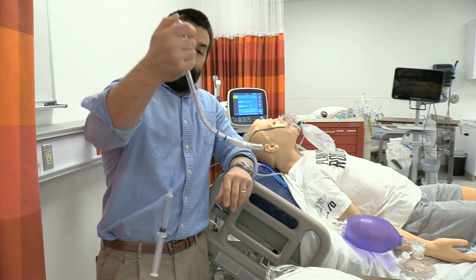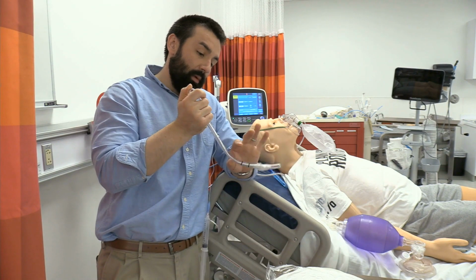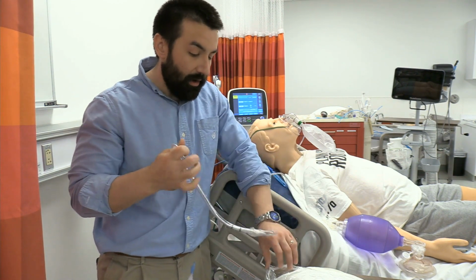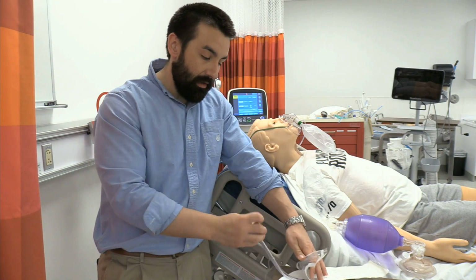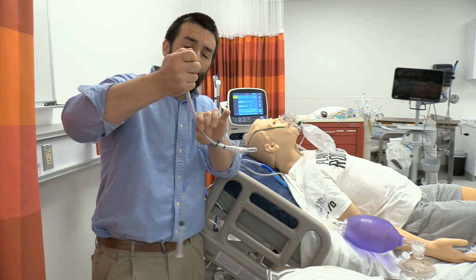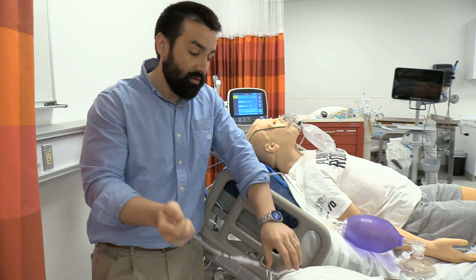I do put a little bit of a hockey stick kind of shape. We want to put a little bit of curvature on that tube rather than be straight, just to help us facilitate entry into the airway, which is a little anterior. You want to put a nice amount of lube on the cuff of that tube primarily. That's going to be what gets hung up on your vocal cords as we're passing through. Be careful with the bend. You don't want to make it too accentuated, otherwise you can actually start doubling over on itself.